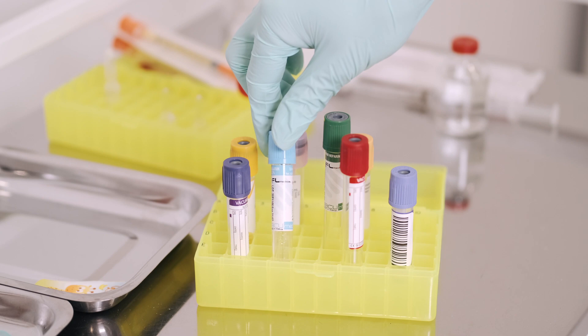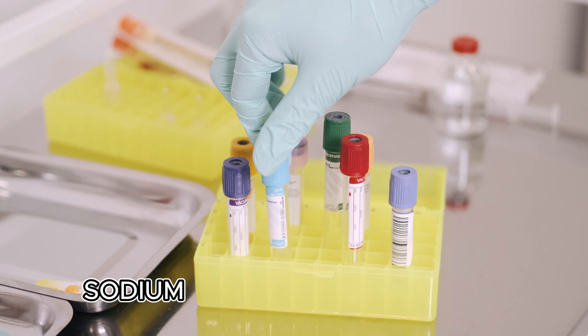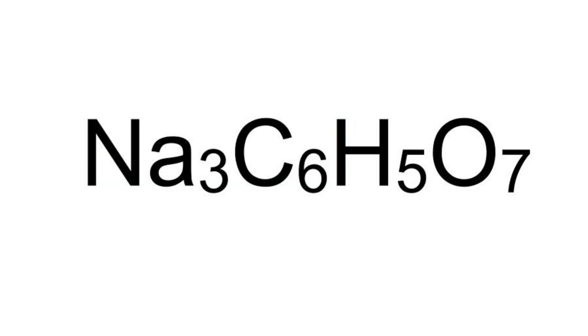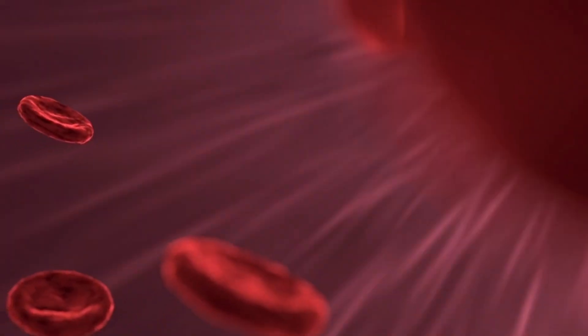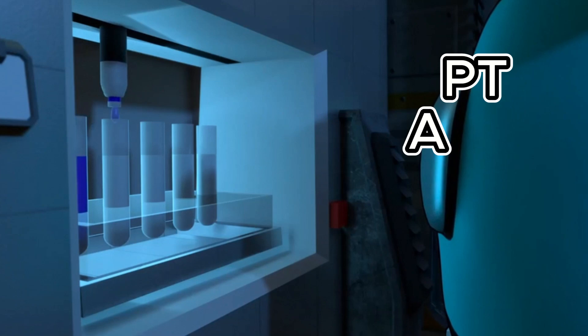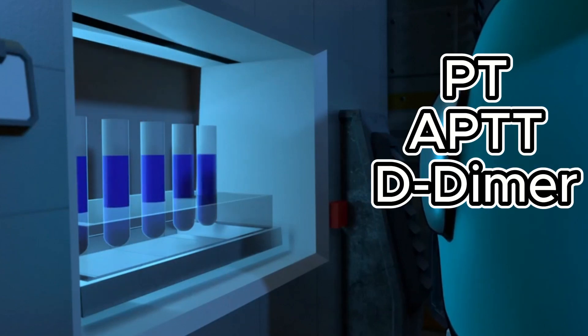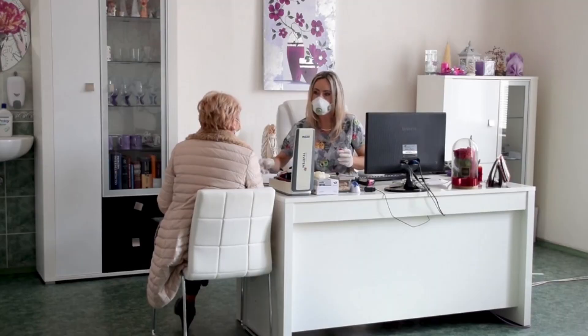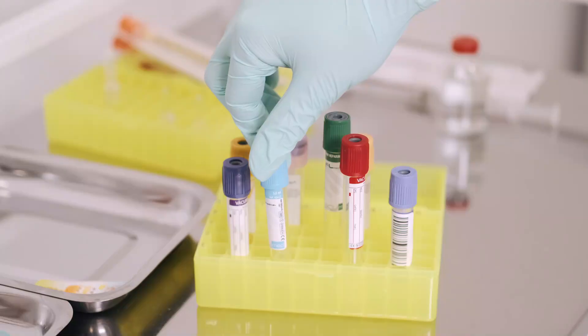Let's start with the light blue tube. This one contains sodium citrate. Its job is to prevent blood from clotting by binding calcium. We usually use this for coagulation studies like PT, APTT, and D-dimer. Basically, if the doctor wants to check how well your blood clots, this is the tube we use.